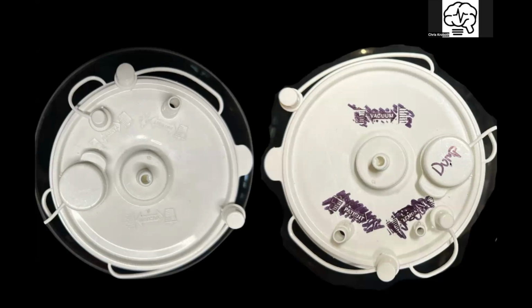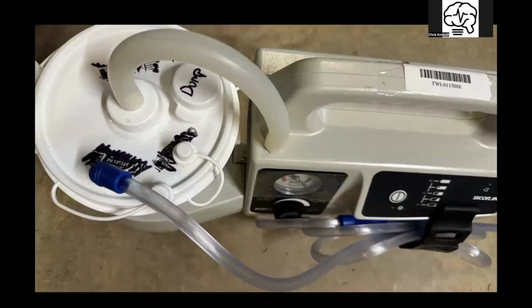That's where if you have that train wreck that is just dumping tons of nastiness in their airway and you want to take this canister out, lift, pop this lid right here, this little port off, and then you can just dump the contents out and then plug that back up and get back to work. This is the tube from the vacuum. This is the tube to the patient. And then we have that tandem port blocked here.